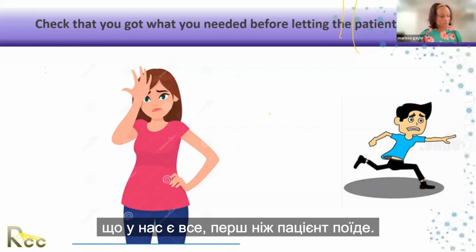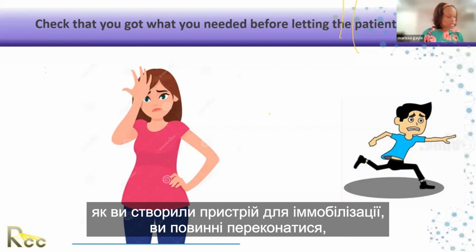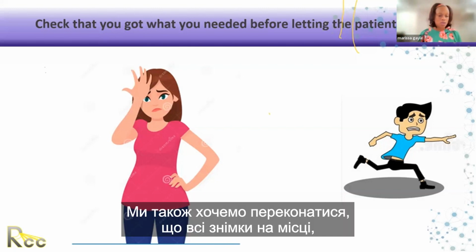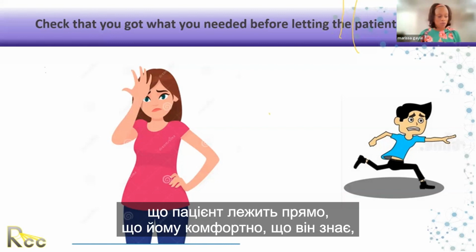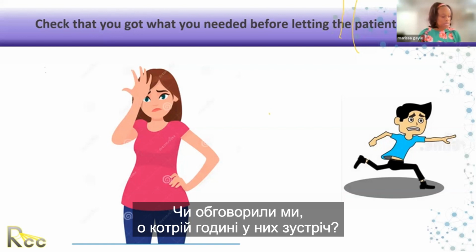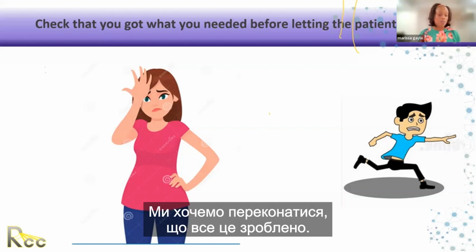So a couple of things that I think are important to know: after you create the immobilization device, you want to make sure everything is labeled for the patient. We also want to make sure that all the scans are in there, that the scans look good, that we made sure that the patient was straight, that they were comfortable, that they know what they need to do when they come back into the department. Do they know when they're coming back into the department? Have we discussed what time their appointment is? We want to make sure all these things are done.